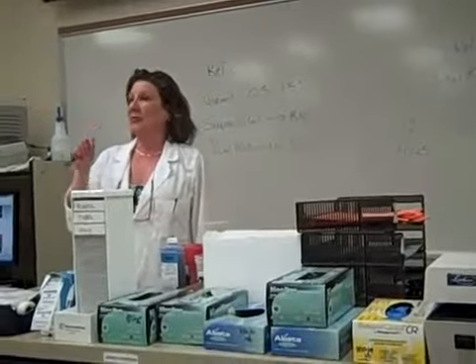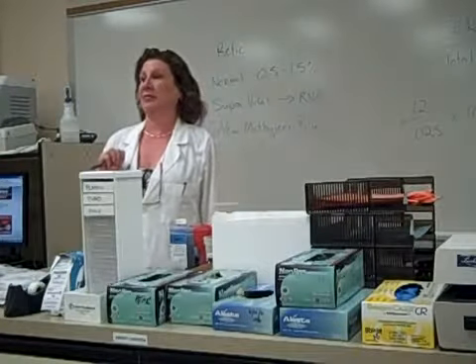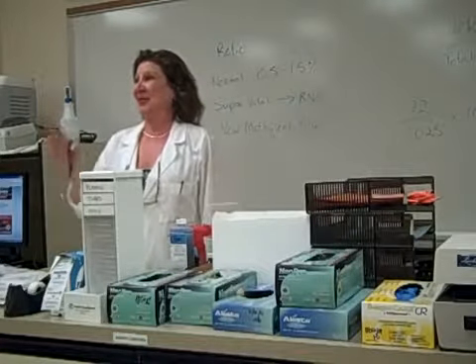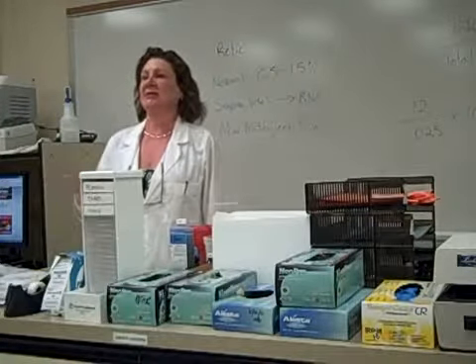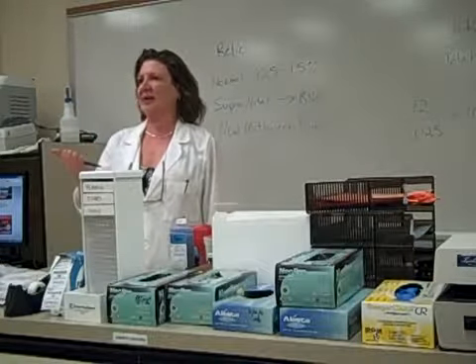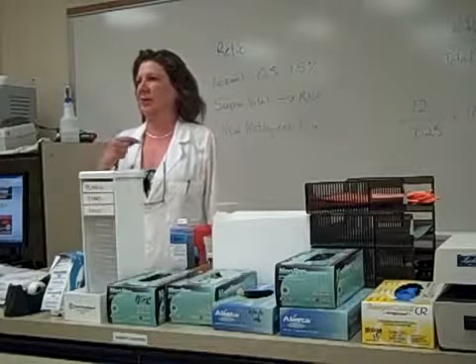But when you look at them today, I want you to do 2, okay? 2 today. Raise your hand when you think you found a retic. Okay, so we're sure you're counting the right thing. There's some artifactual elements that you might think are retics, so I just want to make sure you're actually counting the correct thing. If it's shiny or metallic or refractile, it's not a retic. So don't count it as that.